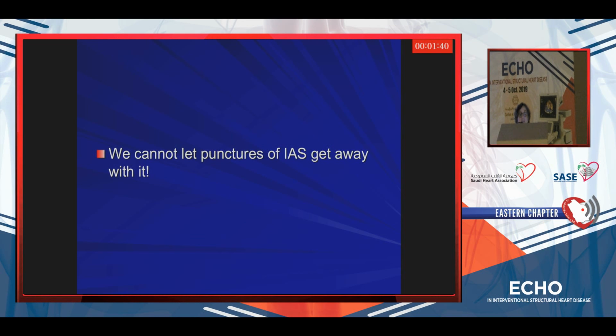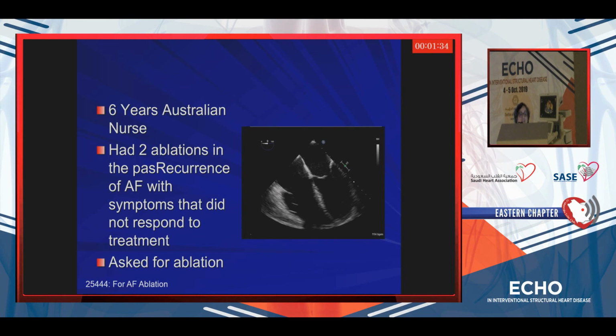So we cannot let the puncture of the interatrial septum get away with it, Dr. Hani. So let's show you this. Actually, there are really two cases. I'll try to finish quickly.